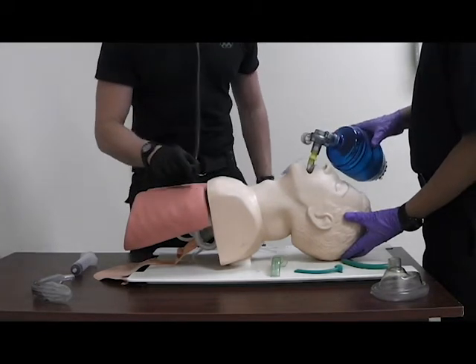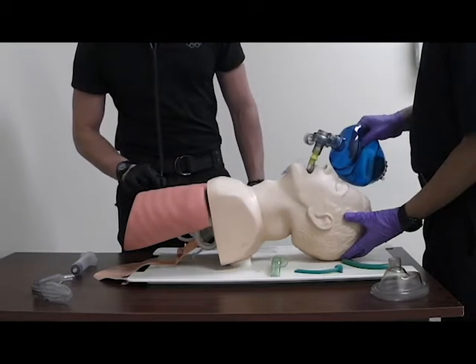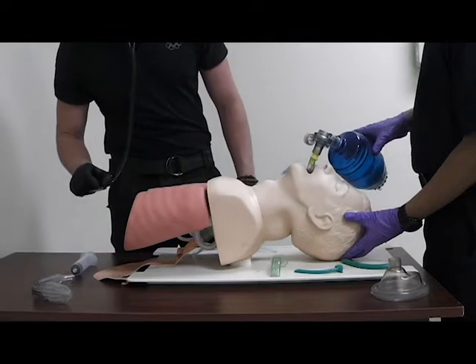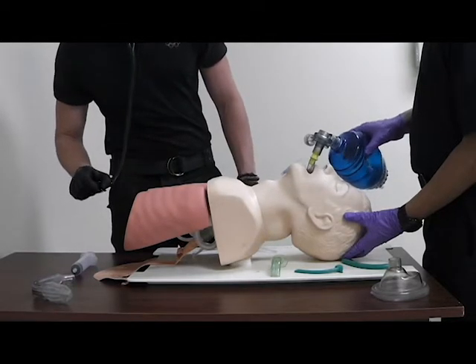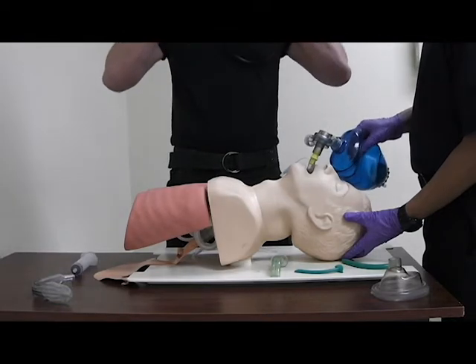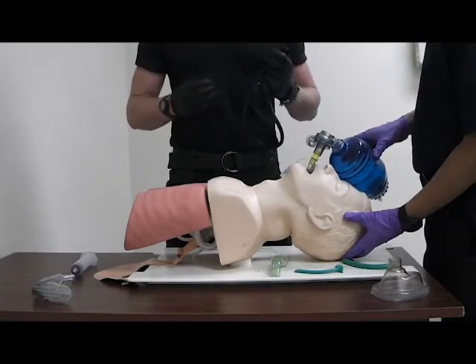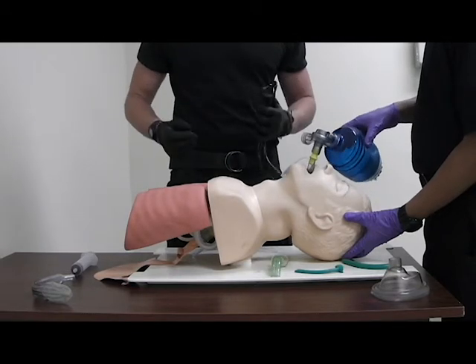Confirm placement by checking lung sounds on both sides, listening for normal airway sounds, and checking for absence of gastric distension, which will sound like gurgling. You can also confirm placement with capnography, and verify that skin condition and SPO2 are improving.